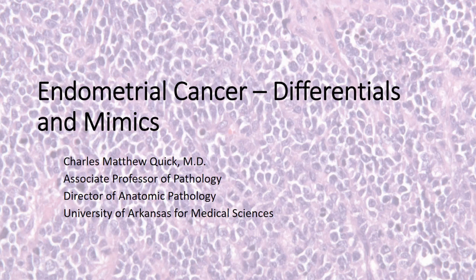We're going to talk about endometrial carcinoma, and I do realize it is somewhat early in the morning, so I thought I might take a slightly lighter approach to this lecture. Instead of just bombarding you with big lists of differential diagnoses, I would give you 6 things that I want you to remember. I'm going to present them in the format of 6 what I would call instructive cases, but hopefully you'll find them that way as well. So with that, we'll go ahead and get started with case 1.